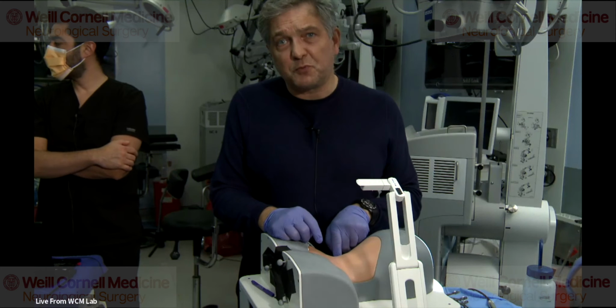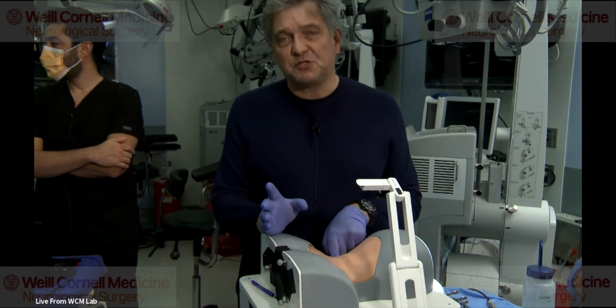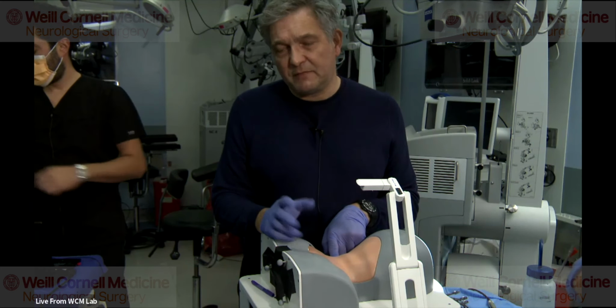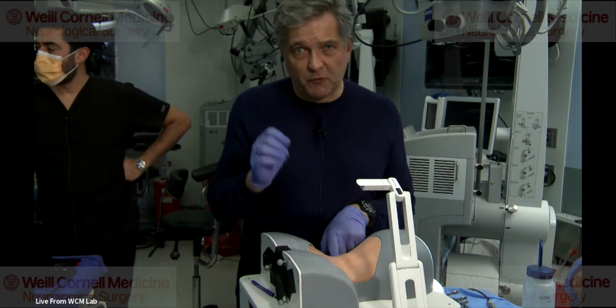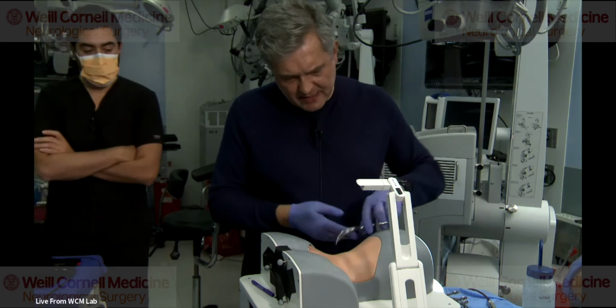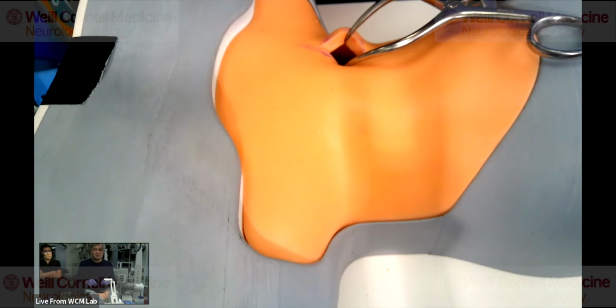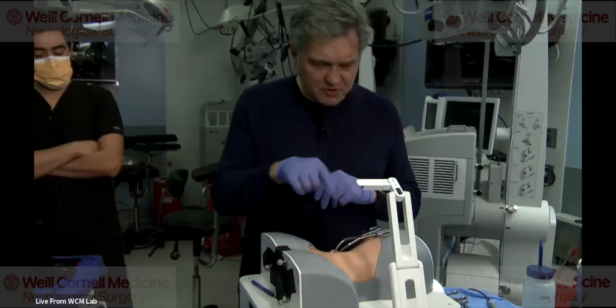In the lumbar case, at this point, I would basically just make a fascial incision blindly and just dilate with the first dilator. I used to do that in the cervical spine, and then it quickly became evident that there's a lot of force that you put on the spine, and there's also a lot of bleeding. So what I do now is I typically put in a little Gelpi retractor, and then I bring in the microscope. And under the microscope, I do a dissection through the muscle with 1 or 2 clamps, almost like you do a VP shunt. For those of you who are neurosurgeons, you dilate through the muscle with 2 clamps and create, with sharp and blunt dissection, your trajectory down to the bone.